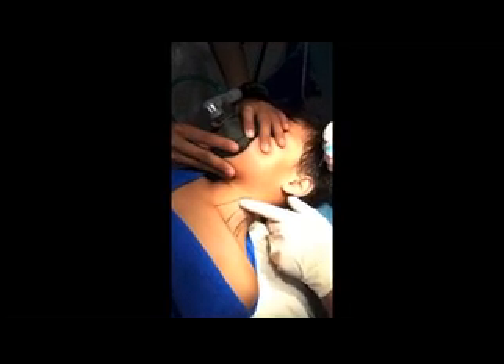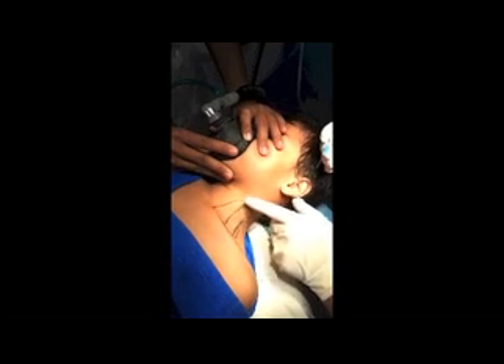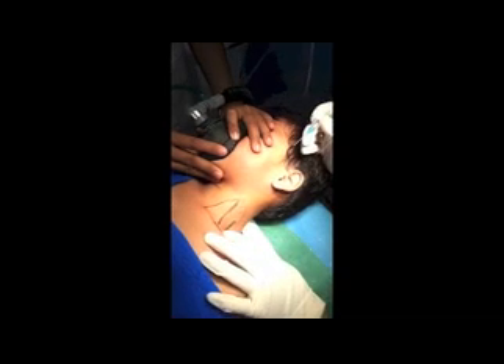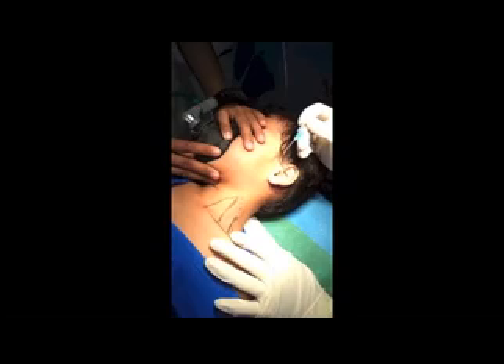So this is the sternal head of the sternocleidomastoid muscle — sternal head — this is the clavicular head and this is the interscalene group. As the surgery is here in the distal part, we will go with the needle here, just above the clavicle.